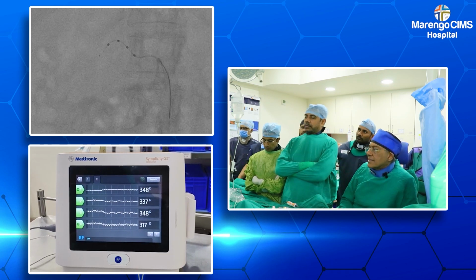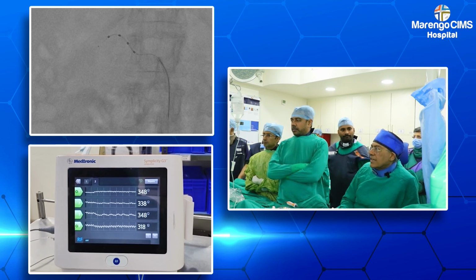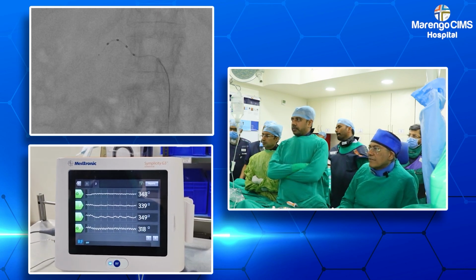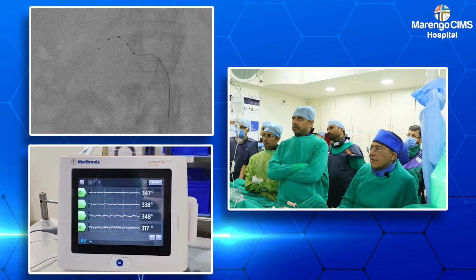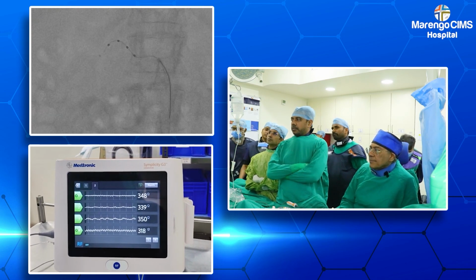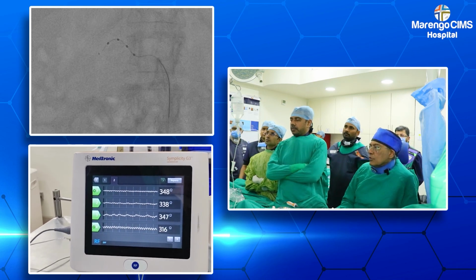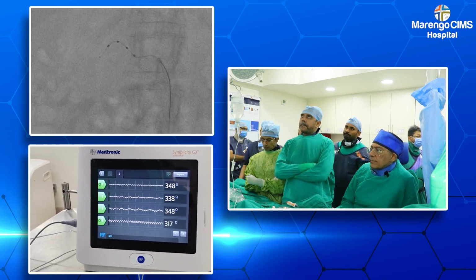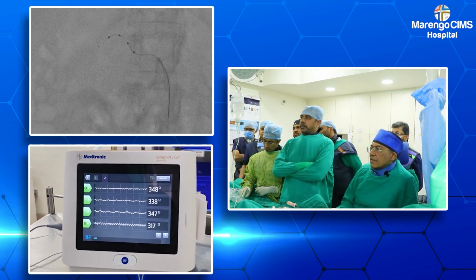Patient is deeply sedated. So in deeply sedated patients, sometimes we may have some variability in impedance, but they are within reasonable limits. So now we have 4 electrodes in good contact in the mid to proximal artery. We have to avoid the ostium. So Dr. Tejas Patel and Vipul Kapoor will initiate the second run of ablation.